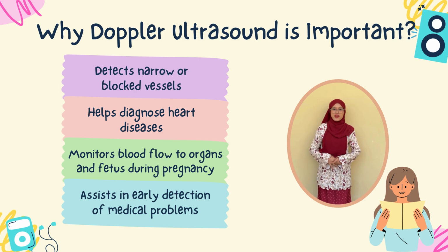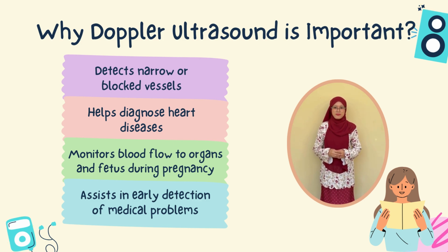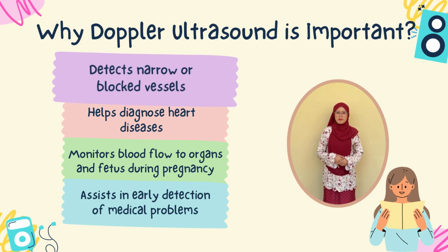Doppler ultrasound is very important in modern medicine because it helps doctors observe blood flow inside the body without surgery. It is commonly used to detect narrow or blocked blood vessels, which can reduce blood supply to organs.